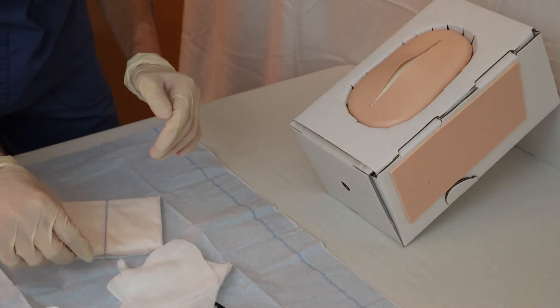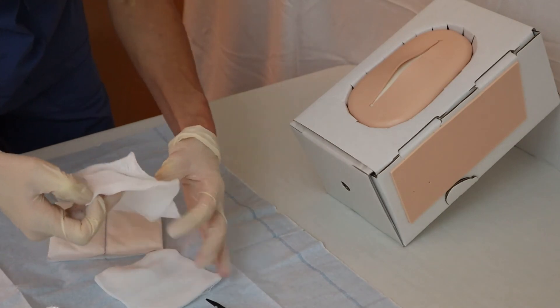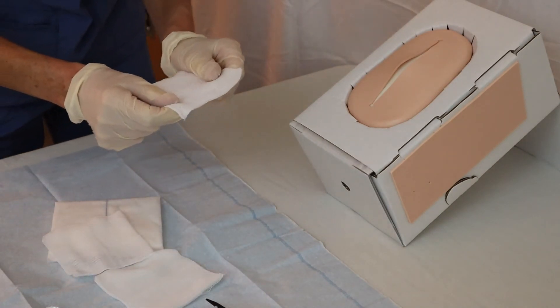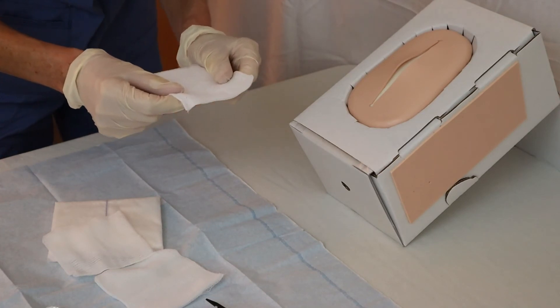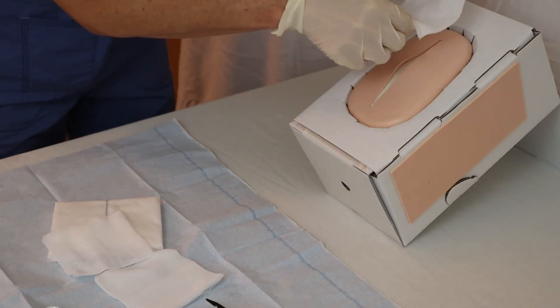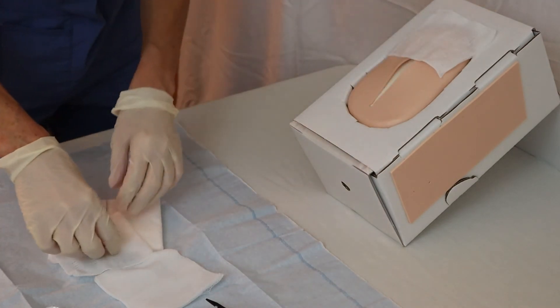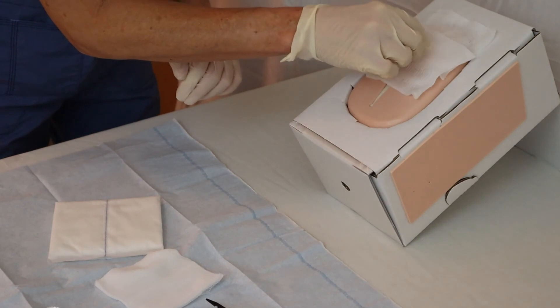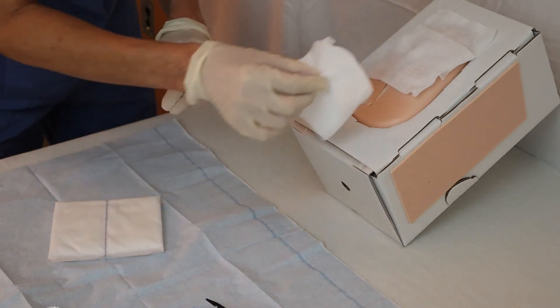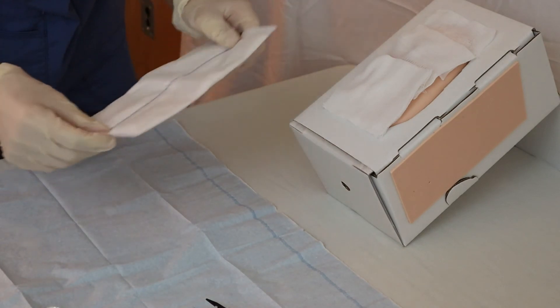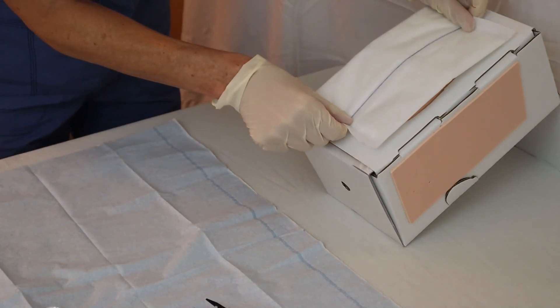Then I'll let that just dry for a couple of seconds. Now I'm ready to put the gauze on. Remember the gauze is sterile so I don't want to touch the patient when I put the gauze on. I can either just come here and carefully place it on there or I can grab it in the middle. And then I'm going to take my ABD pad and place that on top.